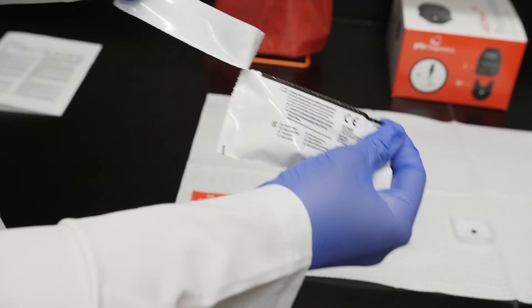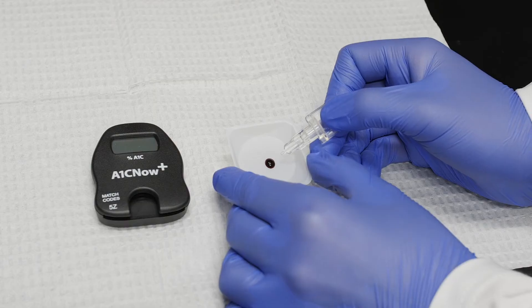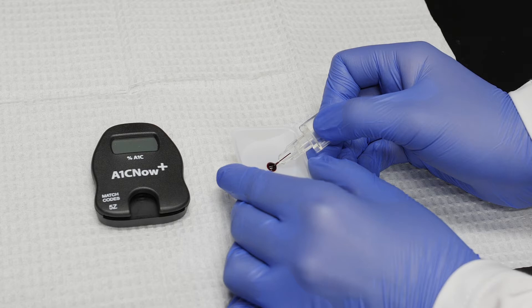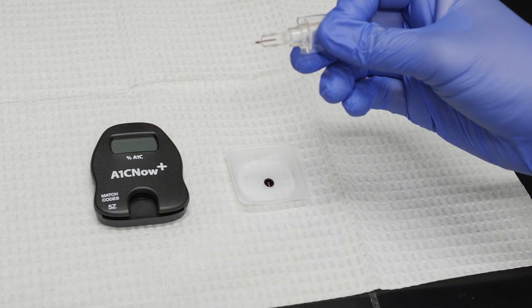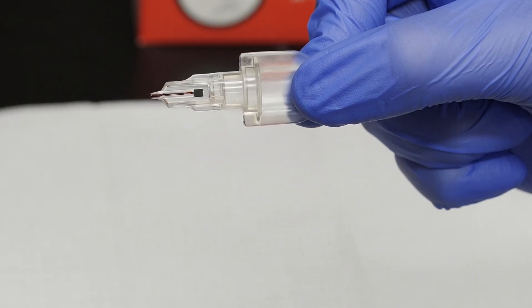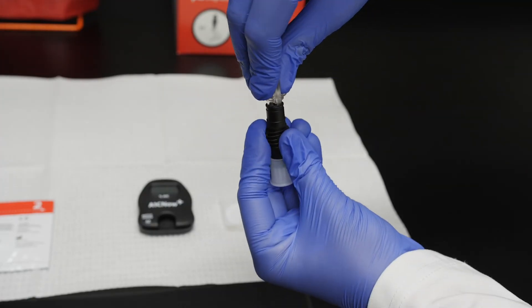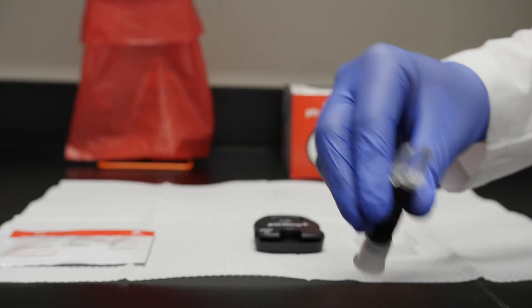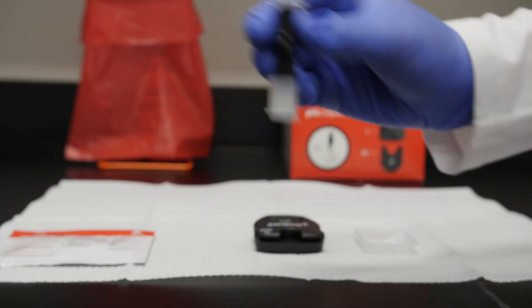Open the shaker pouch from your A1C Now Plus Test Kit. Hold the blood collector at a 45-degree angle and collect the A1C Now Plus Controls solution from your clean, flat surface. Verify that you've collected the appropriate amount of control solution with the blood collector. Insert the blood collector into the shaker body using a twisting motion. Shake vigorously six to eight times, then stand the shaker body on the table.